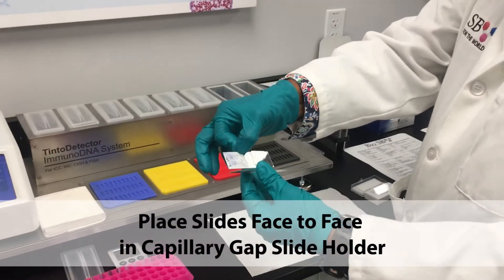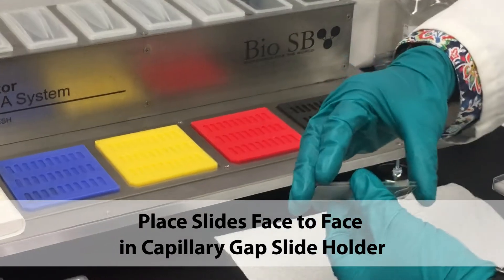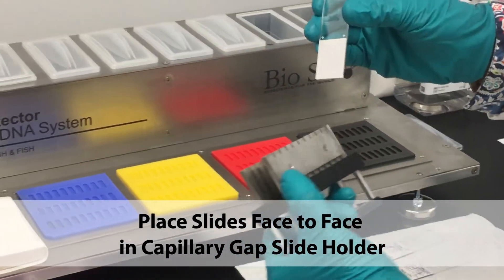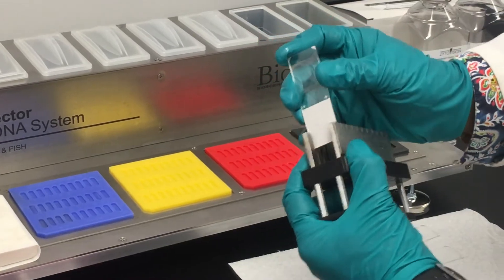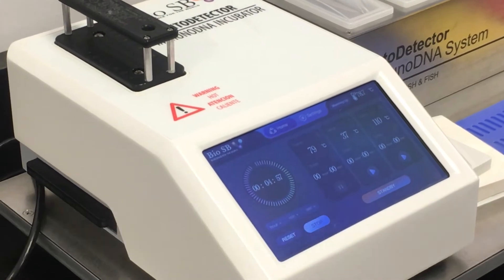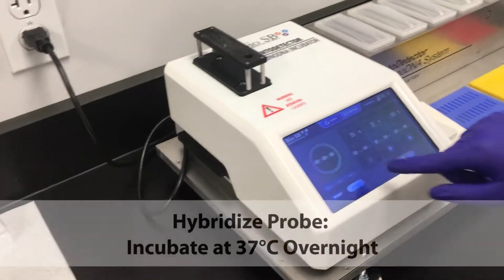When you're done, place the slides face-to-face in the capillary gap slide holder. Place the slide handle into the incubator. Denature the probe by incubating the slides at 79 degrees Celsius for 5 minutes.